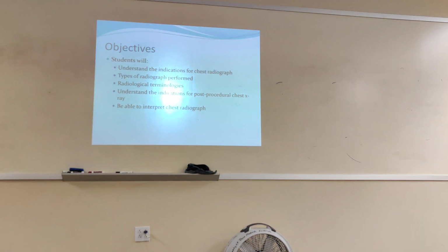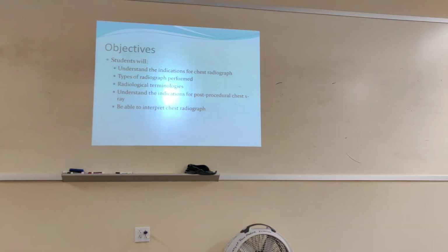These are the objectives: understand the indications for chest radiograph, types of radiograph performed, radiological terminologies, understand the indications for post-procedural X-ray, and be able to interpret chest X-ray.